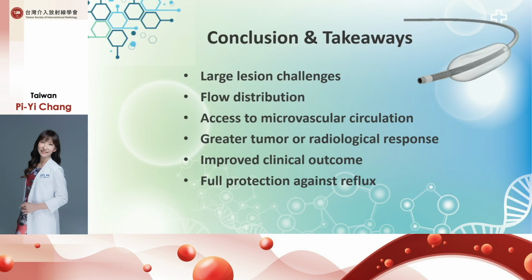So in conclusion, treatment of large HCC lesions is very challenging. B-TACE can provide flow redistribution and access to the microvascular circulation. It can create tumor radiological response, and it also improves the clinical outcome. And the balloon can give full protection against reflux.